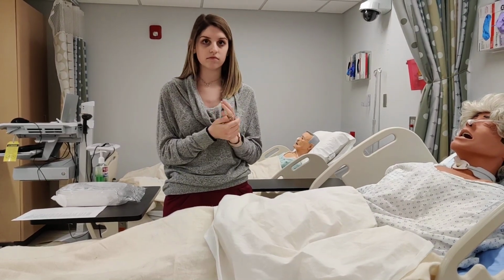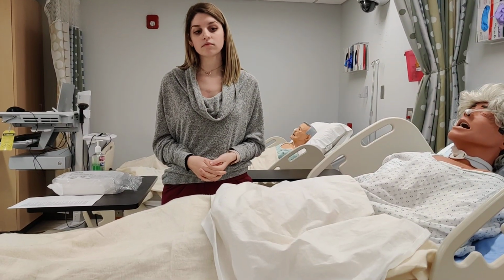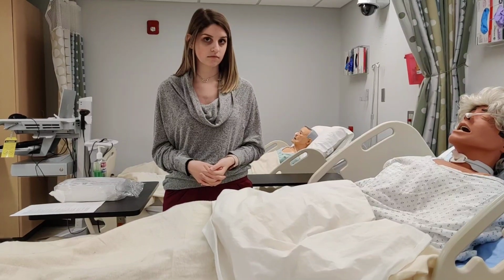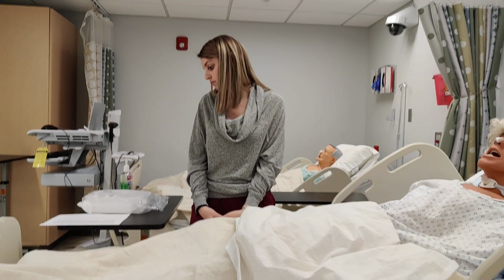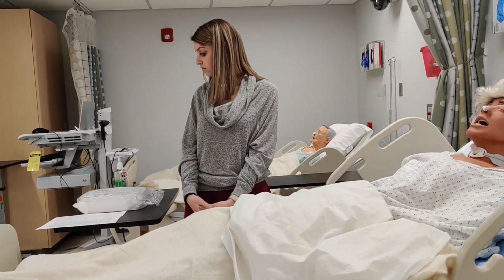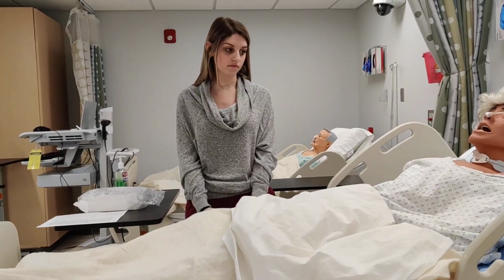Gabby is going to be demonstrating an indwelling catheter placement on a female patient today. Another term that you may hear used quite frequently is Foley. Foley is a brand of catheter, but they're interchangeable. So for lab, you may hear me say Foley or indwelling catheter. Foley is just a shortened version to make it a little bit easier.